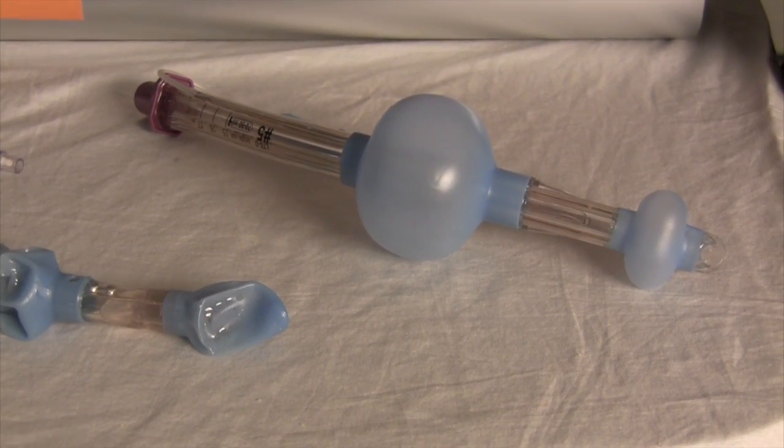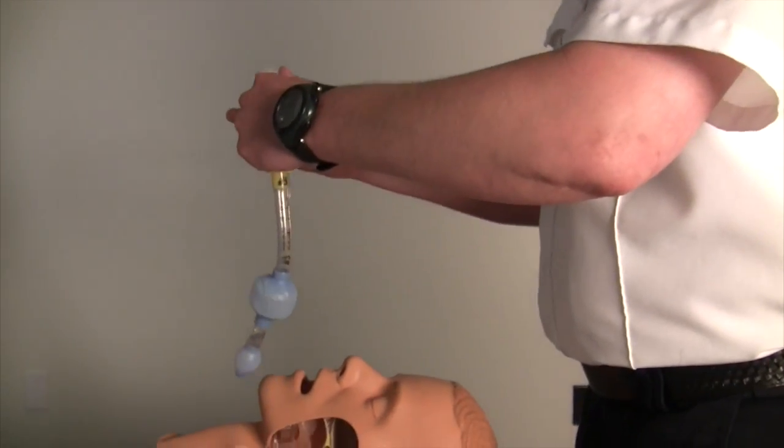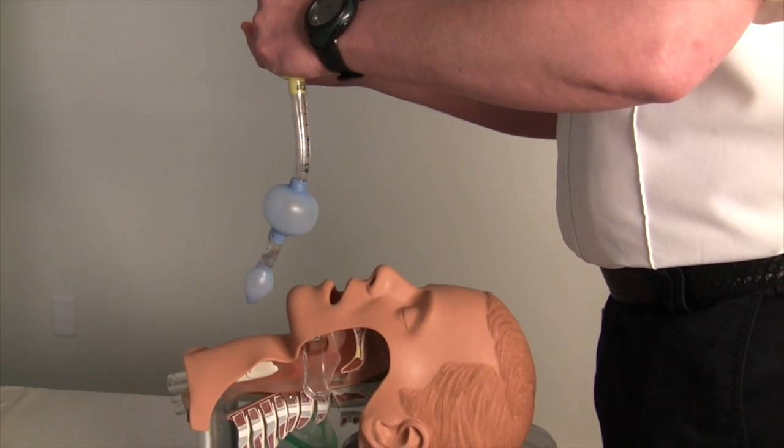The cuff is tested for leaks, and lubricant is applied to the beveled distal tip and the back of the tube. After being ventilated using a BVM device, the patient's head is placed in the sniffing position.